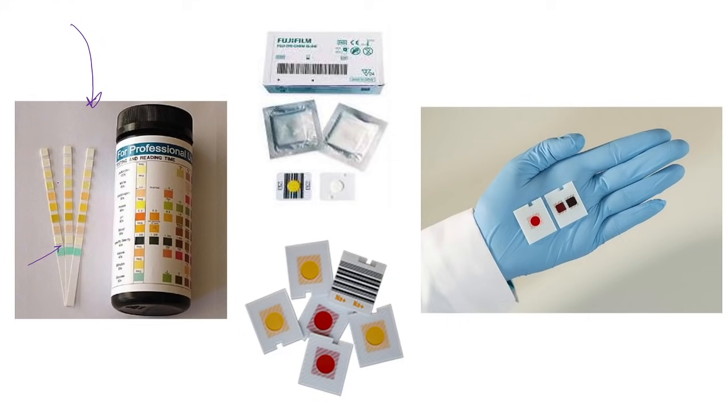Di ba? And all you need to do is just to dip, and then ang kaning mga colors na inyohang makita diri, there will be changes, and then inyohan na siyang tan-awon dayon diri sa inyohang color chart to know kung unsa ang meaning ato na color changes. And then you will be able to know also the results na dayon sa inyohang patient. So again, that is the earliest and best example for that.